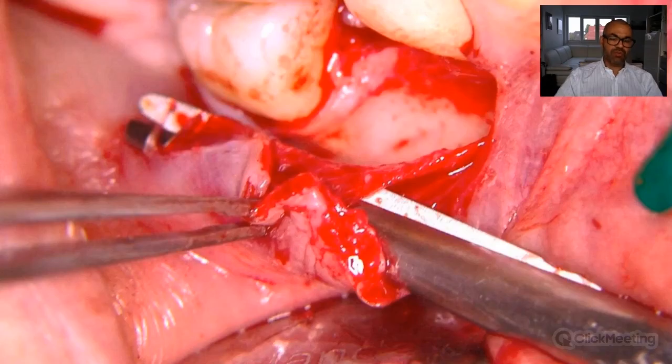And when you go now with the scissor inside this pocket, you can use your scissor like a dissecting instrument. You go from one side to the other side, and what you do is you dissect the tissues. You dissect the periosteum from the epiperiosteal connective tissue. This is what all plastic surgeons do when they do, like, a facelift.